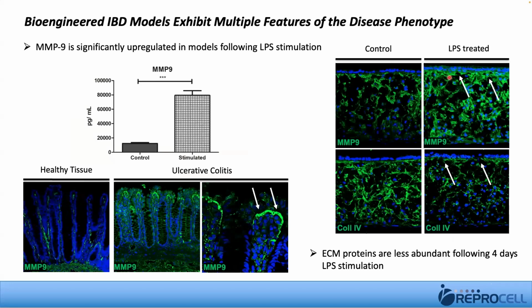And very interestingly, there are also changes to the extracellular matrix within the model. So we noticed in our model MMP9 levels being enhanced beneath the basement membrane. So we went back to the pathology tissue, and we noted and recorded for the first time the observation of MMP9 expression being very high at this area in the tissue. So that's an example of how studying these bioengineered human models can also then impact on our understanding of what's going on in the pathology of the disease.